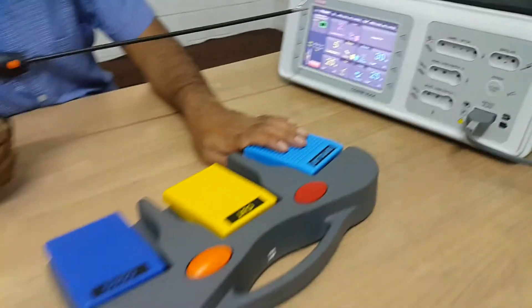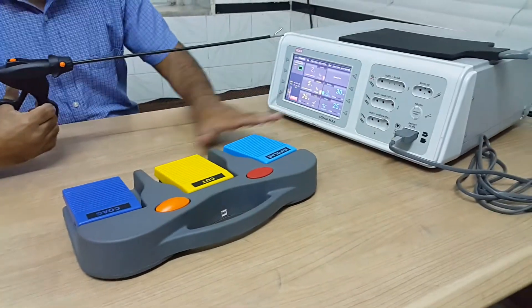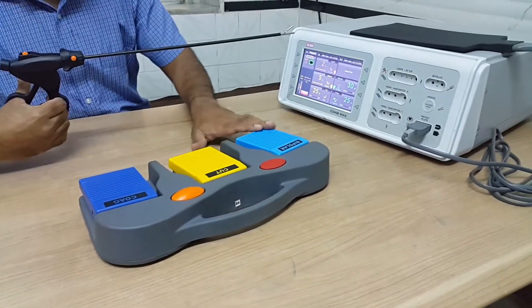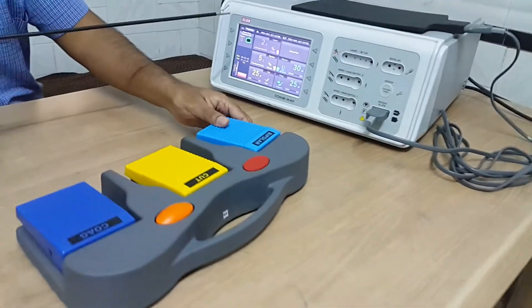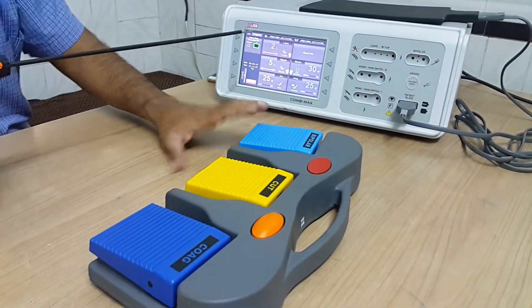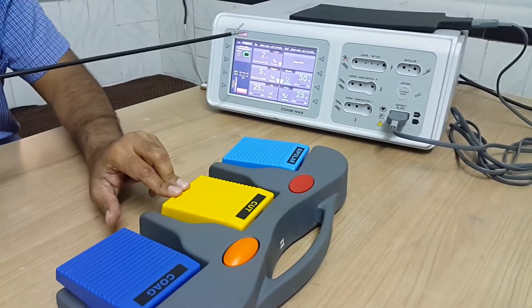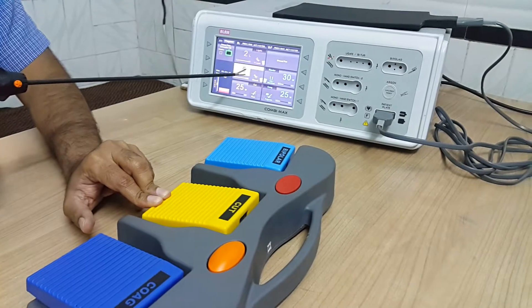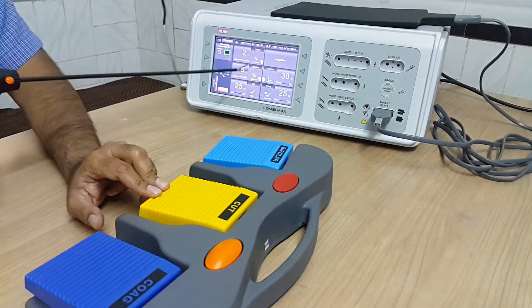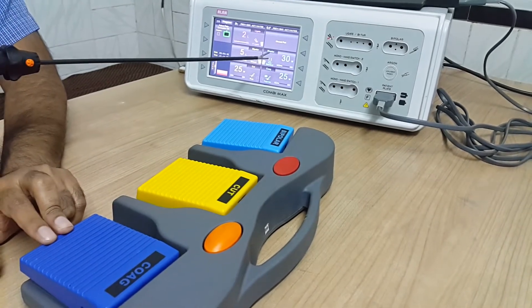This is a wireless foot switch. This foot switch can be programmed to activate all three modes. For example, I have programmed it so that pressing the first foot switch activates ligate, pressing the second activates dissect mode, and pressing the third activates simple bipolar.